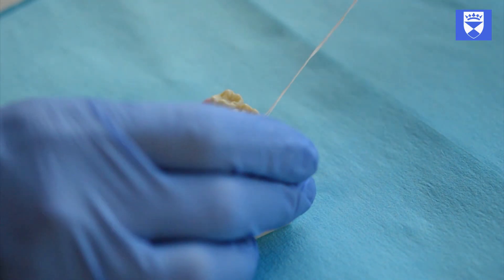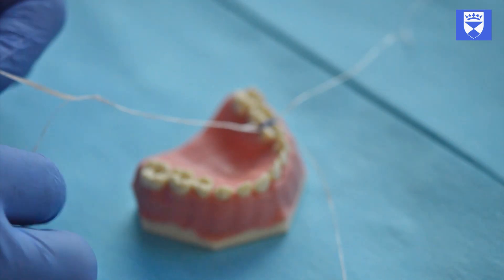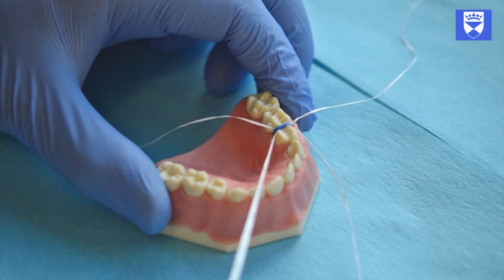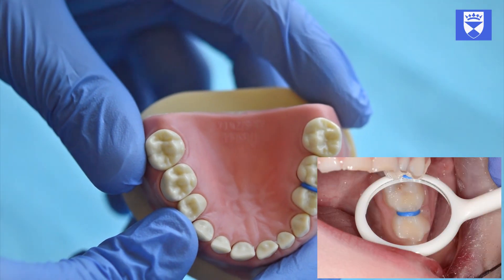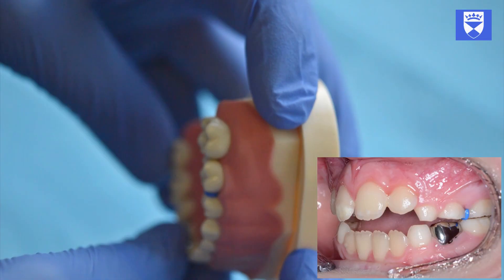If you are happy that the separator is in the correct position, release your grip on one end of each piece of floss. Gently pull on the floss to remove it. When working with a patient, it is often useful to get them to help at this point — instruct them on how to remove the floss and allow them to gently pull one end.